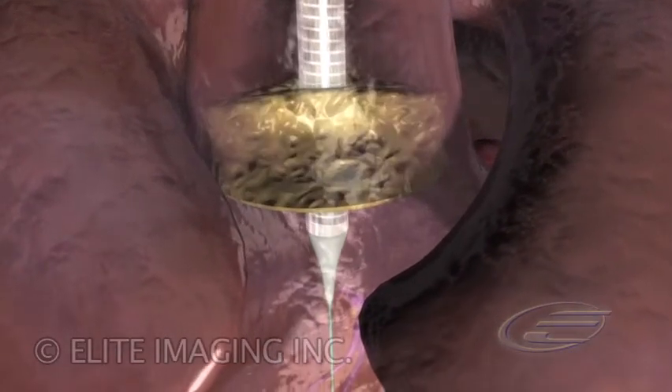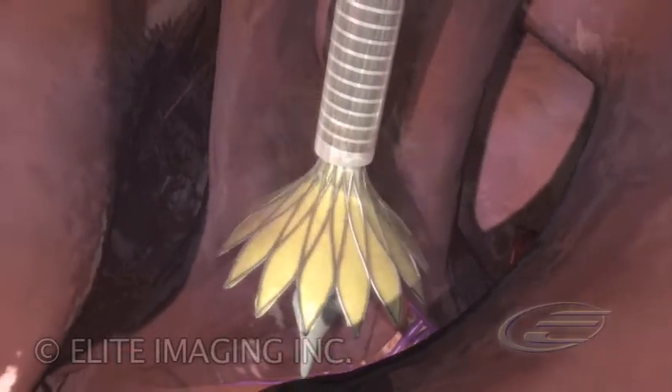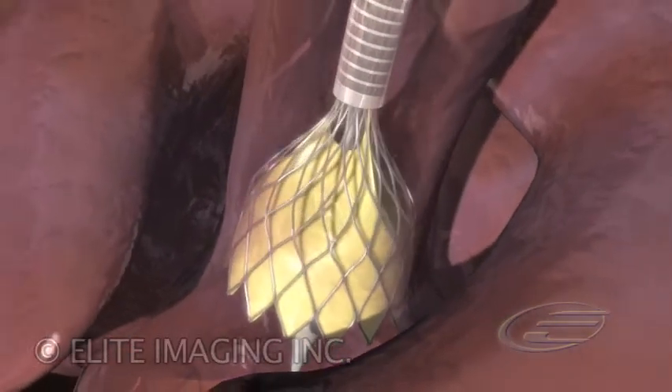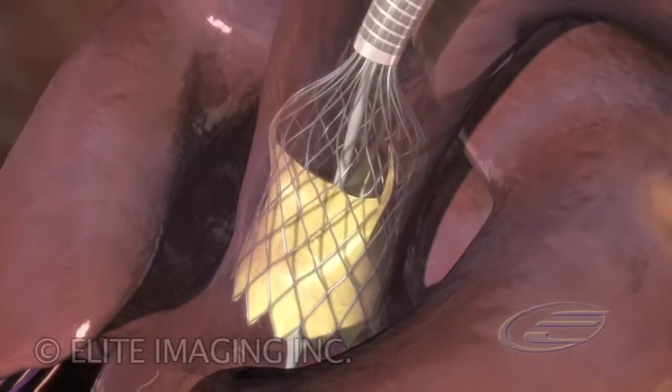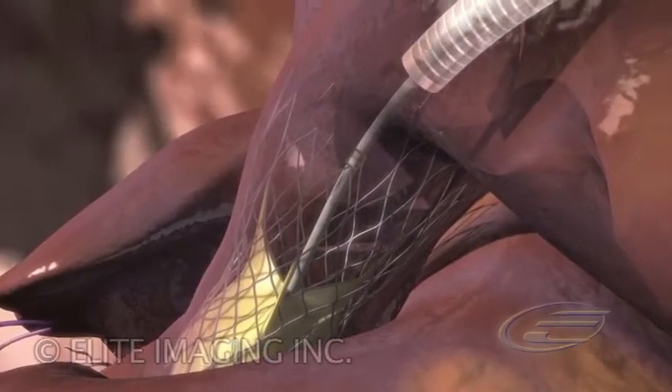The external sheath is progressively retracted, deploying the framed valve and pushing aside the native valve leaflets. The new prosthesis is securely anchored by the radial force of the frame and starts functioning immediately during placement.